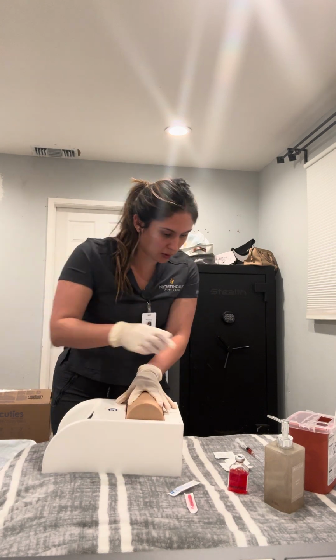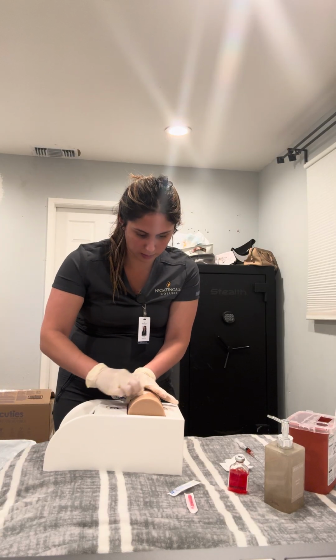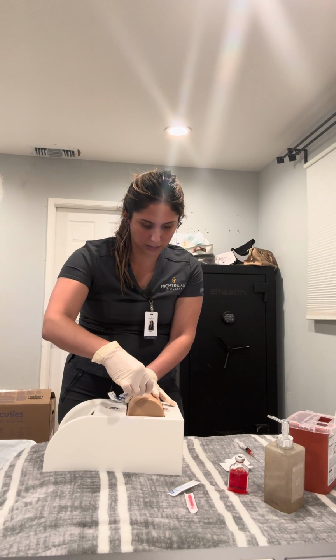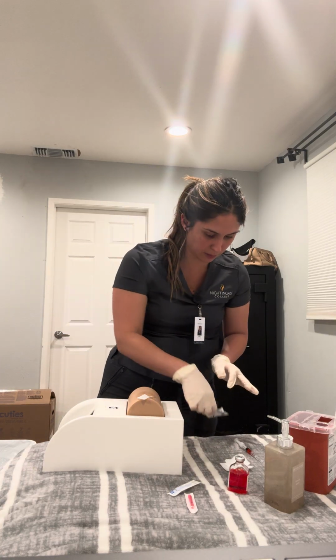So that's going to be about here. With my alcohol, I'm going to clean circularly from the inside out, and I'm going to leave my fingers here to see where my injection site is going to be.